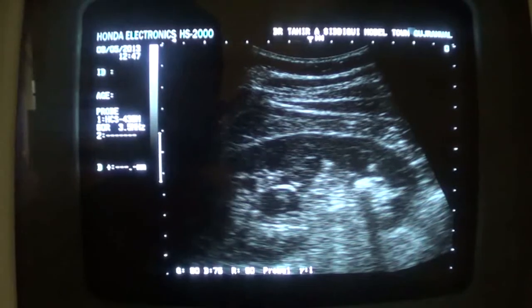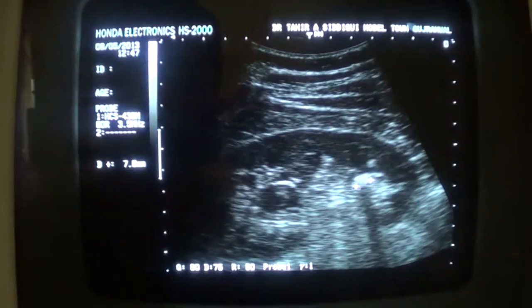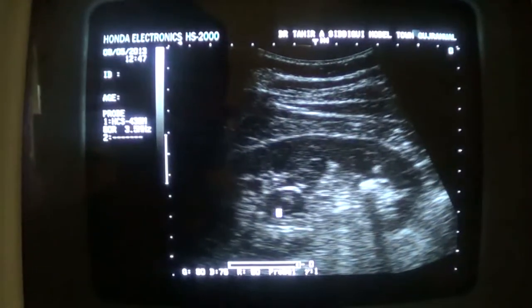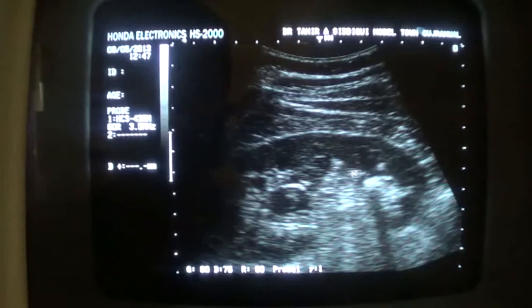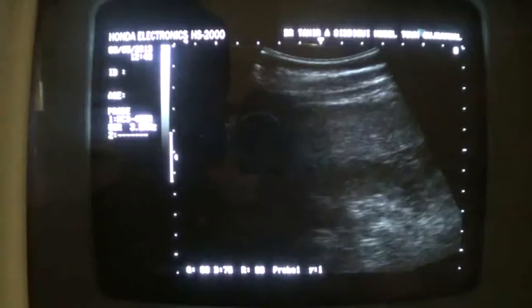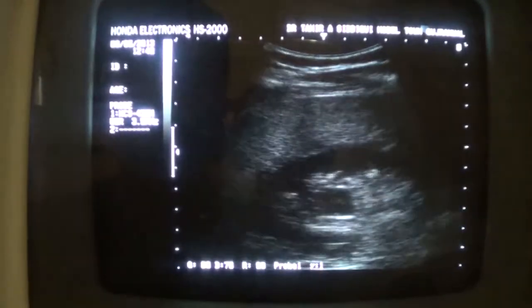Now this is a true calcification in the lower pole calyces measuring 7.6 millimeters. This is a small cyst, which is common in medullary sponge kidneys. Now these echogenicities are again not arcuate vessels. These are suggestive of being tiny calcifications below the renal pyramids, or in the renal pyramids, I would say.